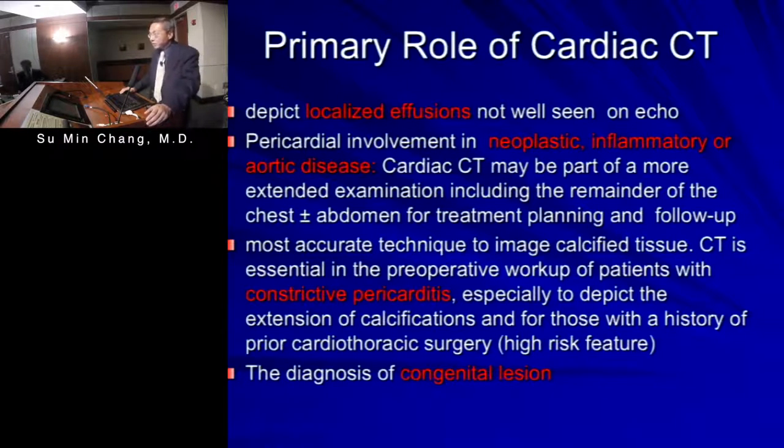And in patients with systemic involvement of the pericardium, especially in neoplastic cases or aortic cases, CT is used not specifically for the pericardial process, but to fully evaluate the patient before you treat the patient. And then I think the major role of CT is assessment of calcification in suspected constrictive pericarditis, especially in those patients who you plan to send to surgery. And obviously, congenital lesions, now we're seeing by echo, CT could offer a very good assessment.